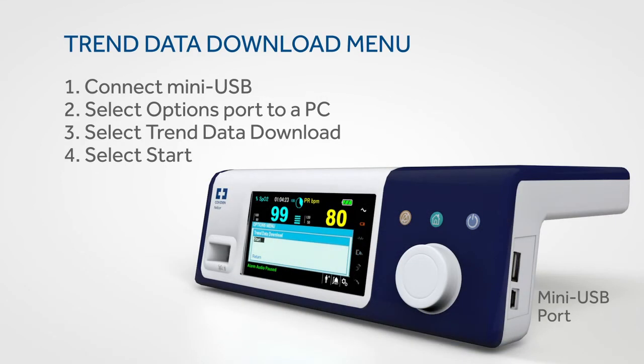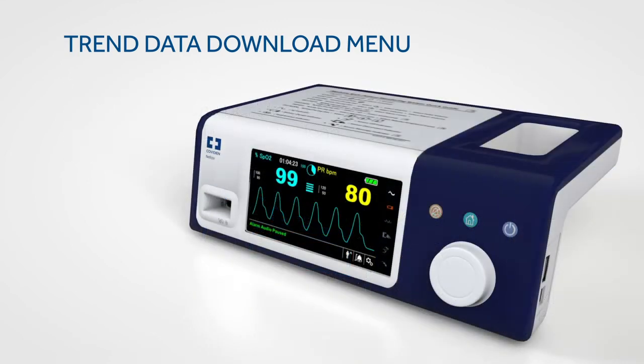You can download your patient's data using the functions in the trend data download menu. To access this menu, rotate the jog dial to highlight the options menu and press.